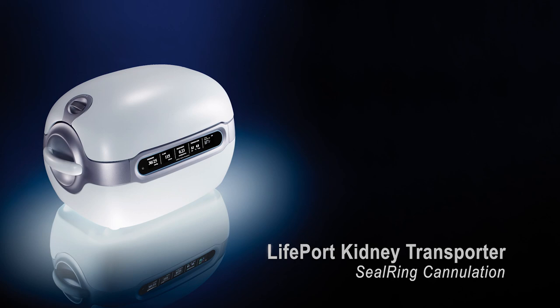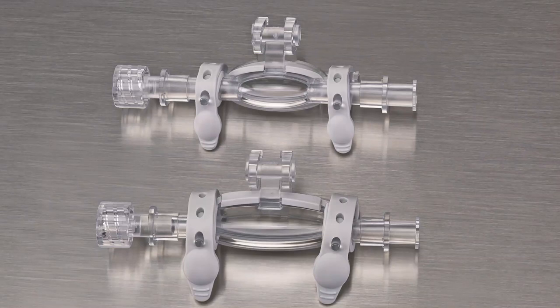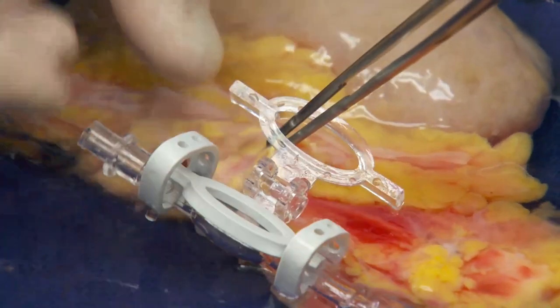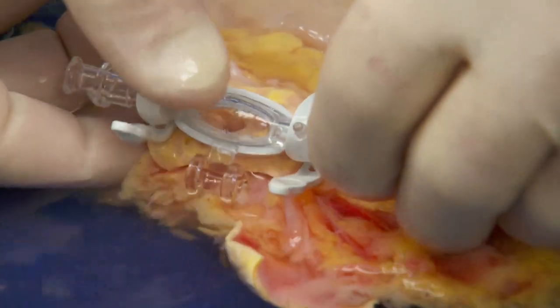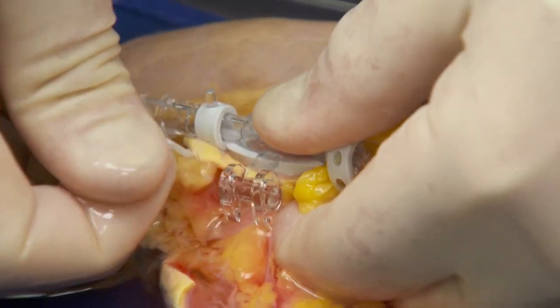Cannulating the kidney with a Seal Ring Cannula. Seal Ring Cannulas come in two sizes: the 7x20mm and the 10x35mm. Both can be used when there is sufficient aortic patch available to create a seal. The 7x20 can incorporate multiple arteries that are close together into a single cannulation; the 10x35mm can be used for arteries that are spread a little further apart. Start by opening the cannula and placing the rigid bottom portion over the aortic patch. Using non-traumatic forceps such as DeBakeys, reach to the center of the rigid plastic portion and gently pull the patch into position on top of the cannula. Once the patch is laid flat, close the top portion of the cannula onto the patch to create the seal, then tighten the outer rubber tensioning straps to complete cannulation.